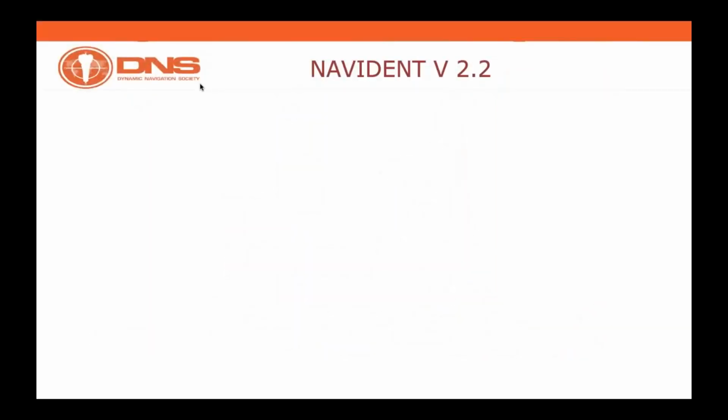So, having said that, and that was just a small introduction for the newcomers, for those of you who haven't had the opportunity to work and live and breathe with Navident. The opportunity we have today is to present you with Navident 2.2.